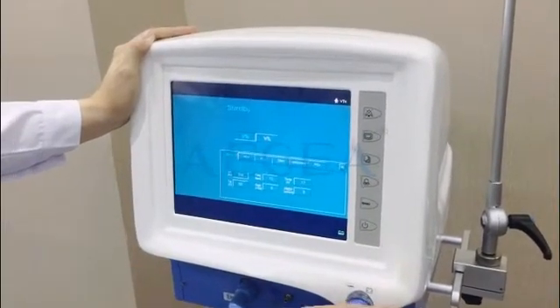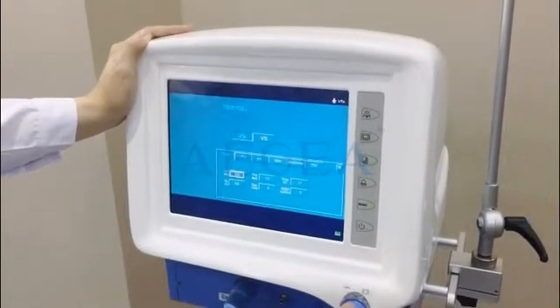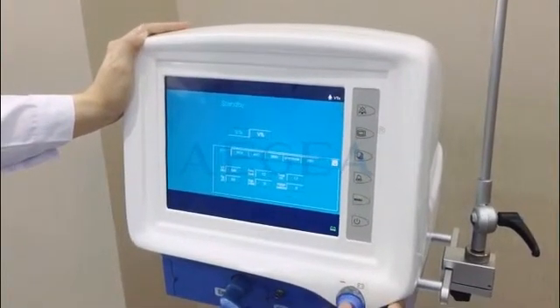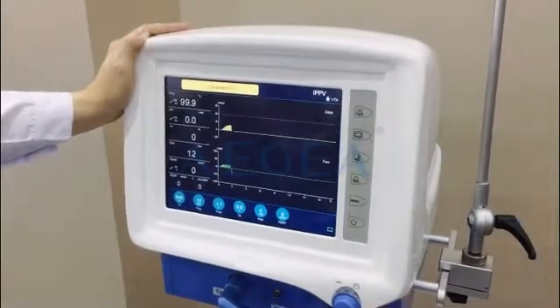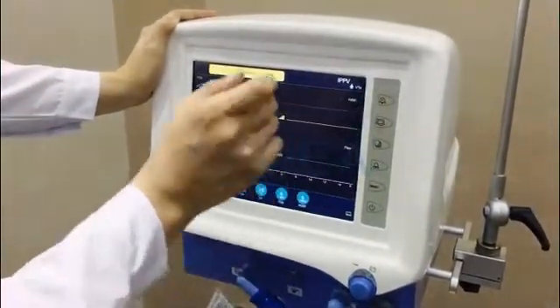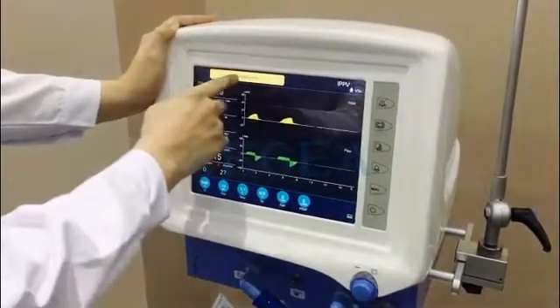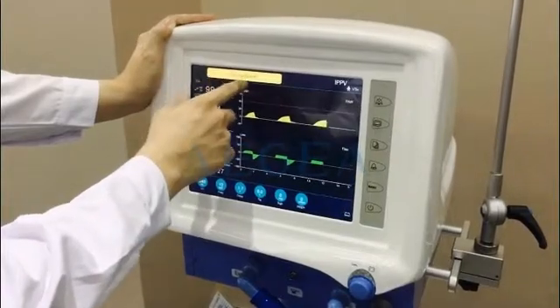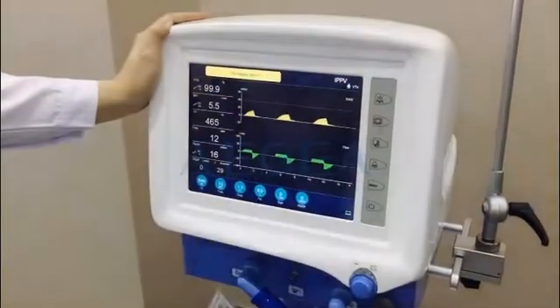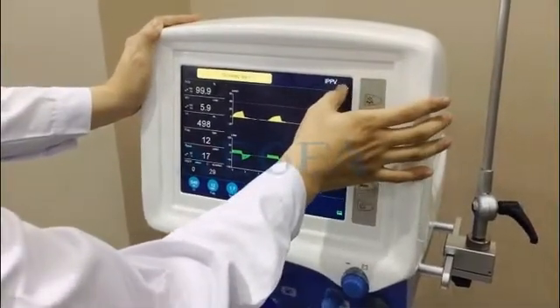We can change the adapters. Then it goes to this interface. We can see there are several icons on the screen. Here is the space for the alarm, and the mode of ventilation, and the mode for adults or children.